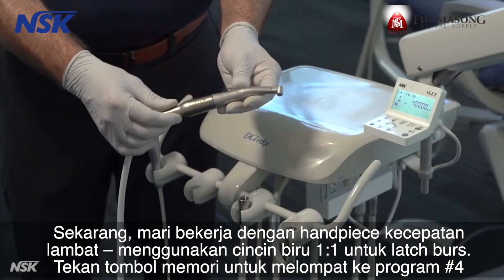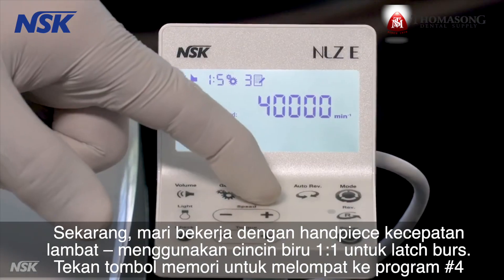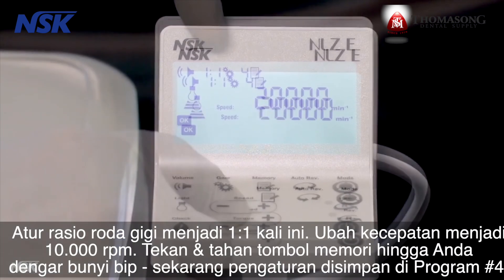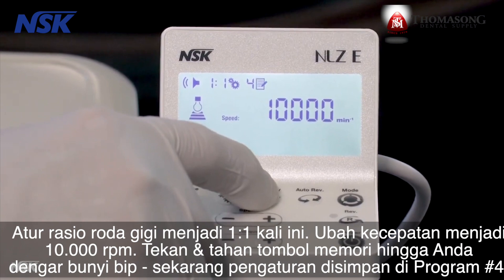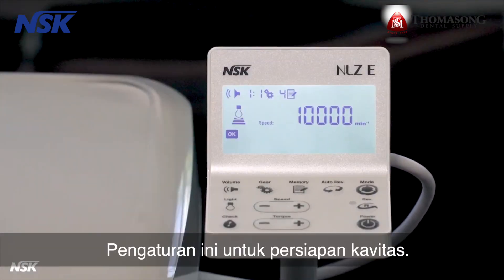Now let's work with a slow-speed attachment using a blue ring, one to one, for latch burs. Press the memory button to jump to program number four. Set the gear ratio to one to one and change the speed to 10,000 RPM. Press and hold the memory button until you hear a beep — the setting is stored as program number four. This setting is for cavity preps.